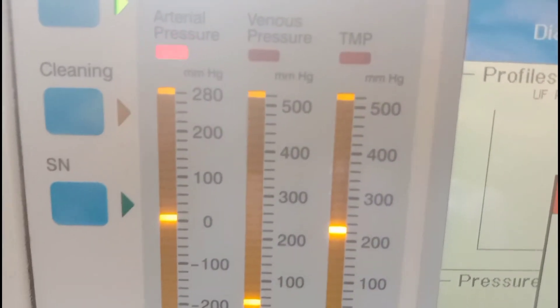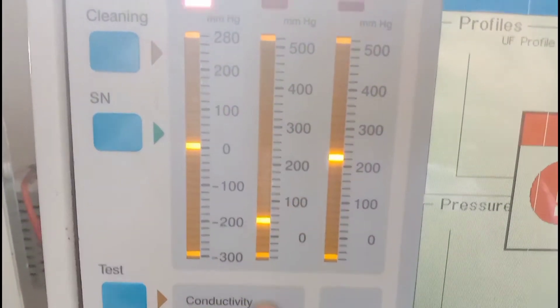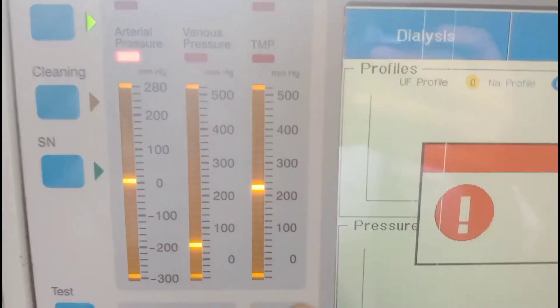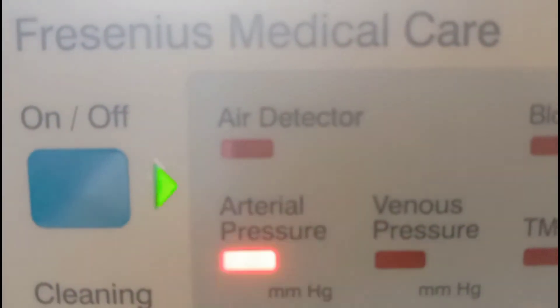This is the place where the transducer for the venous pressure monitor is connected, and venous pressure readings are shown on this panel. You can see here the range for venous pressure. Beside venous pressure there is a panel for transmembrane pressure.